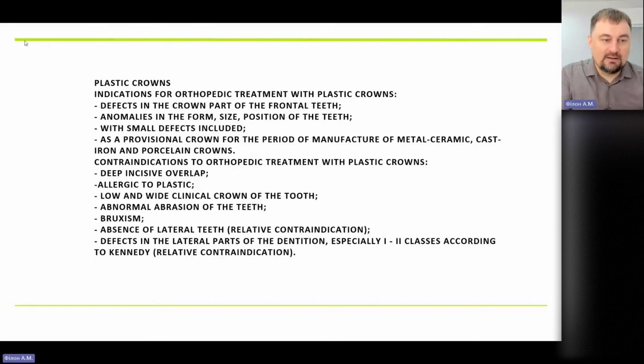It means you cannot use such a material, even temporary, even for one or a couple of days, because you can easily get a very difficult allergic situation, and it's going to make your relationship with your patient very difficult. And later you have to think about treatment of that allergy. And of course, at the same time, you have to change the plastic crowns for something else.